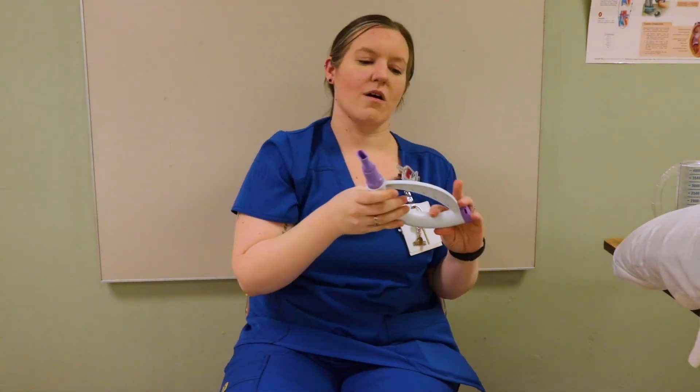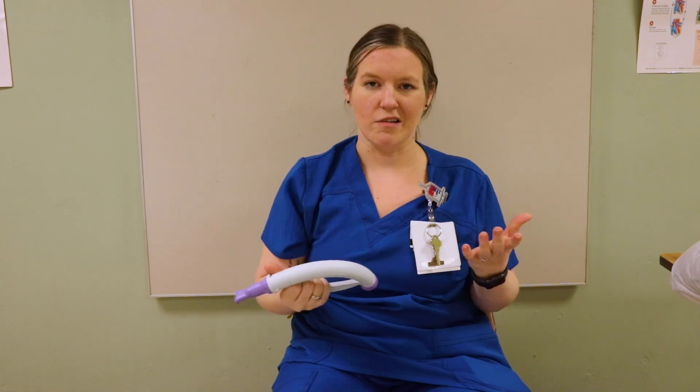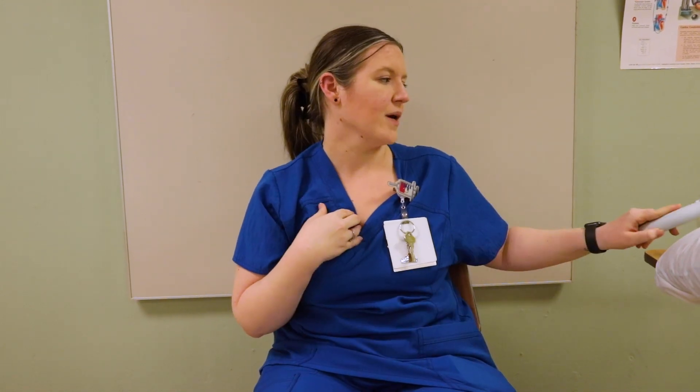Then we've got this little device called a flutter valve — other places may call it something different. The patient puts their mouth on the mouthpiece and blows into the device, and it makes a little vibration sound. It helps vibrate the lungs and break up any mucus.